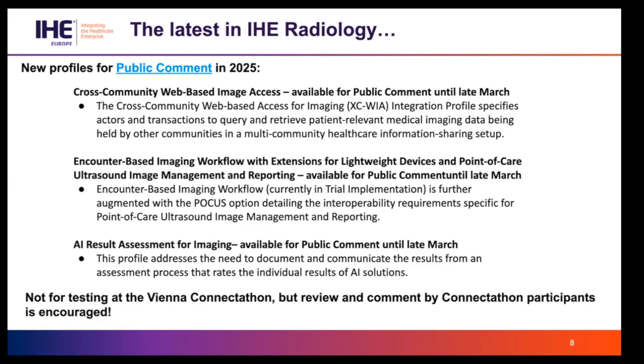So this profile, being very significantly based on the original profile, introduces the capability of using modern RESTful web services in DICOM web transactions to allow communication through cross-community lines, including the federation, or having the ability to have communities which are held within larger communities.